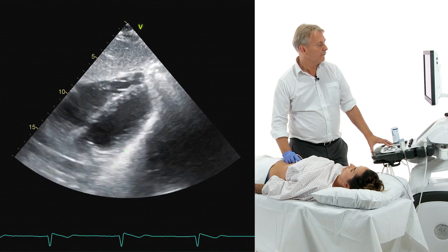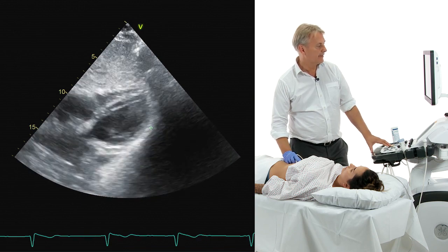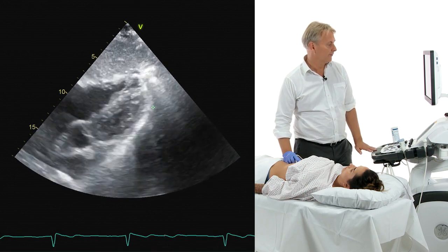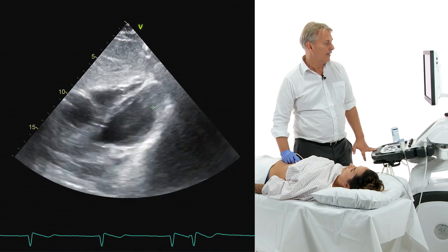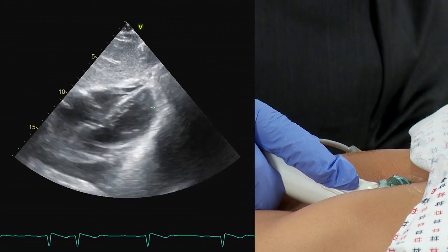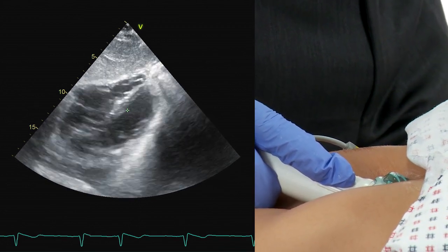Now, very frequently you cannot see the apical structures because you have gas. So the subcostal view is usually not ideal to really image the apical structures. But you can use variants of the 4-chamber view by just rotating and also tilting the transducer. Thereby, you can even display kind of a 5-chamber view. Here, you would have the aortic valve.